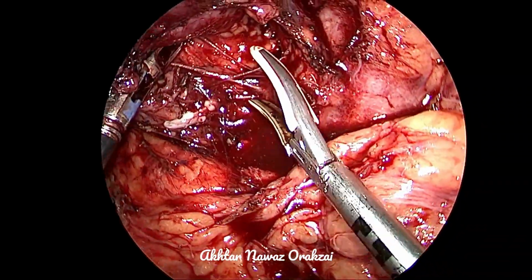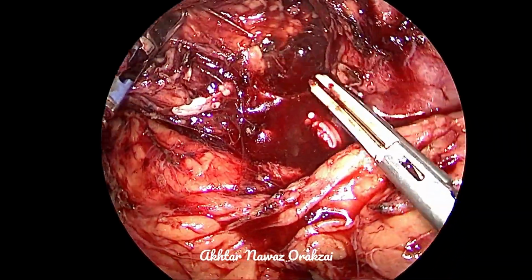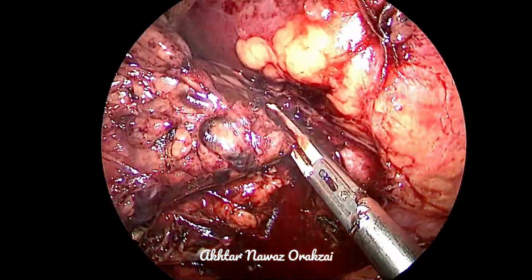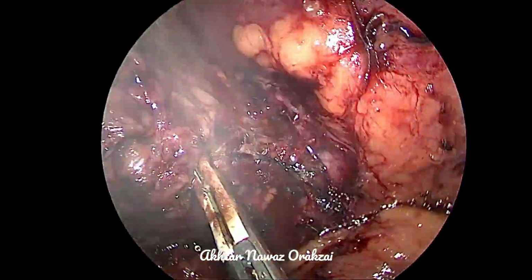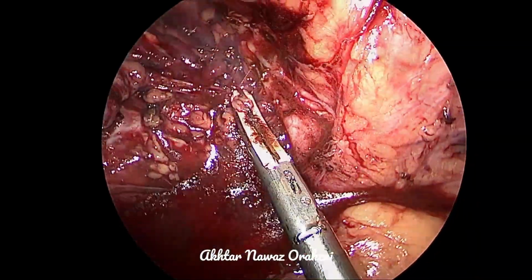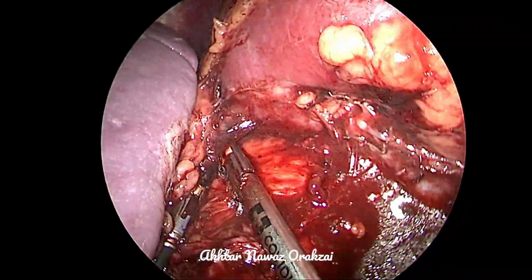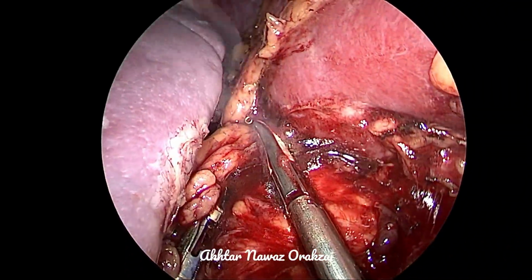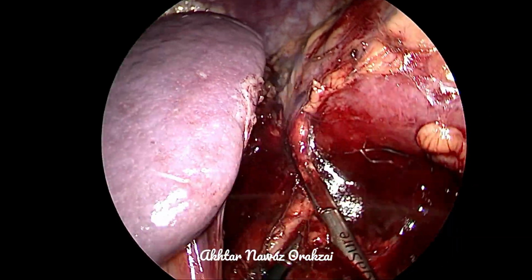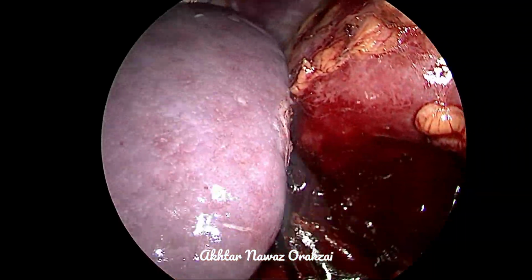So we encounter a lot of small congested vessels. So there is a little ooze as well from those vessels, but the good thing is that we are staying away from the renal vein tributary as well as the renal artery. So we don't really bother about the small vessels which are bleeding at the moment. From time to time, you have to go to the upper pole to dissect a bit more, so that mobilization of the adrenal gland can be good. And then we come to the medial aspect.